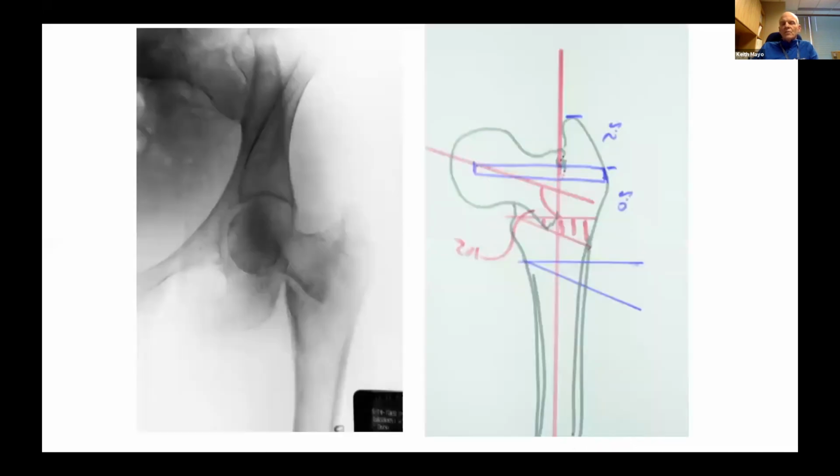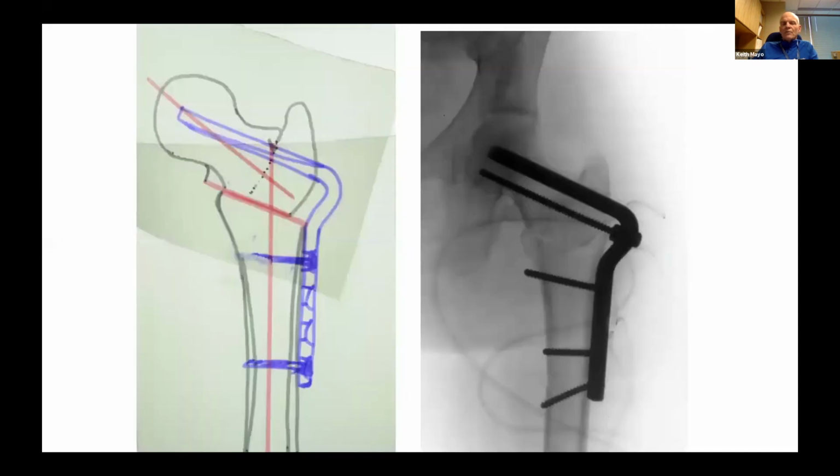You can also correct the axis. It's rare. This is the patient who had a stroke, is nominally ambulatory. This is where he came in at 3 weeks. It's basilar neck. We don't know how long he is, but we can, in this case, just correct to CCD axis with an arbitrary closing wedge that will get him back to a normal CCD angle, and with a little more fixation given his underlying osteoporosis.